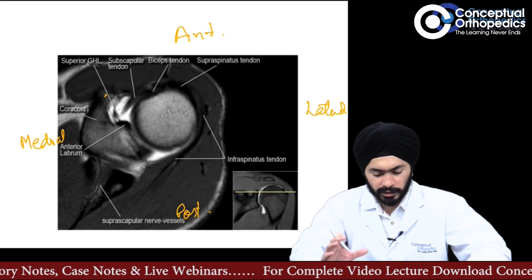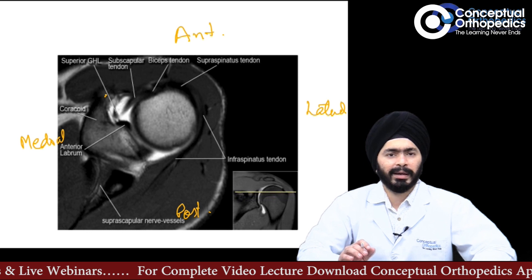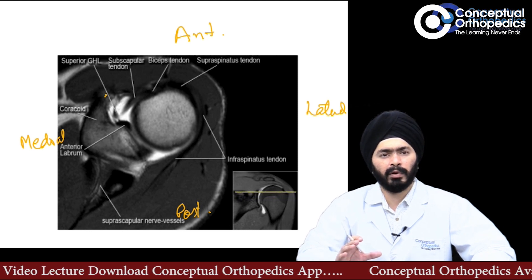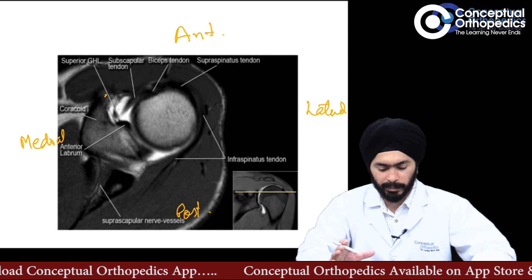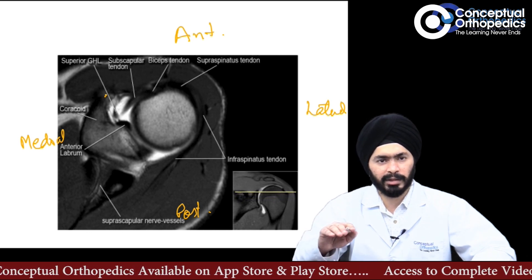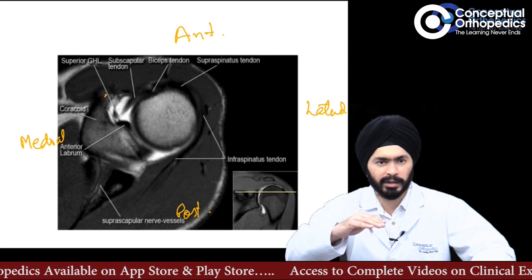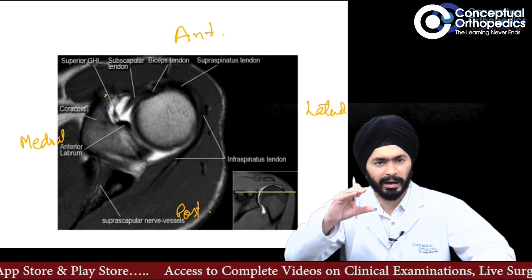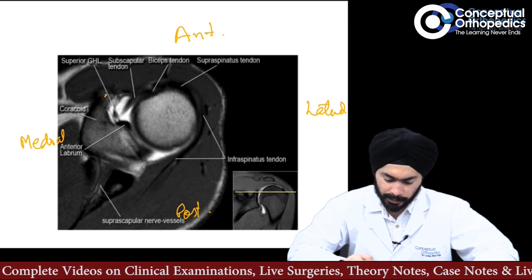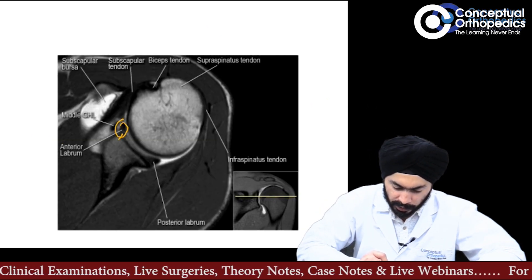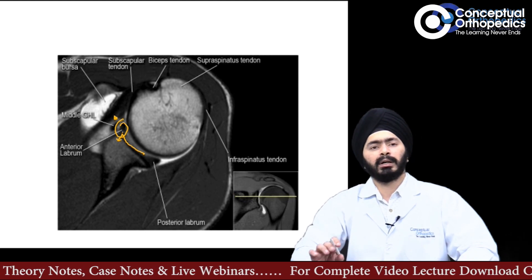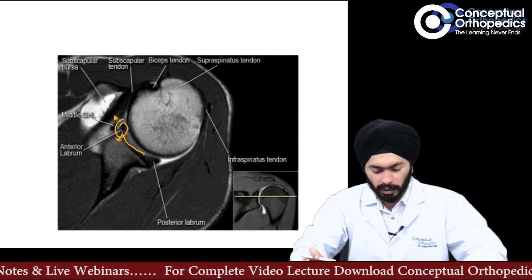On axial sections, what is important to look for is labral pathology — tears of the anterior or the posterior labrum. When looking for a Bankart lesion, which is a tear of the antero-inferior labrum, you want to look at the inferior sections. When the coracoid disappears from the axial sections, that means you have come into the inferior section — you are below the equator. If the anterior labrum is missing or torn in those sections, that indicates a Bankart lesion. The anterior labrum should be firmly attached to the glenoid; if it is detached or displaced, the glenoid labrum is torn anteriorly — that is your Bankart lesion.